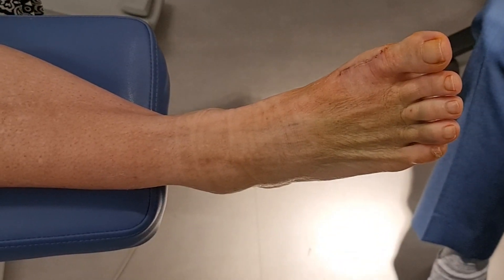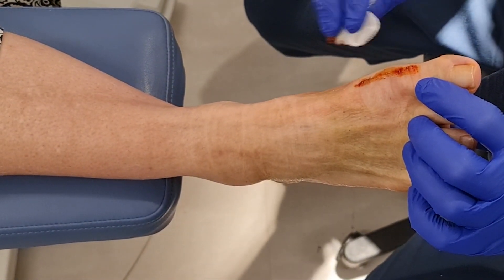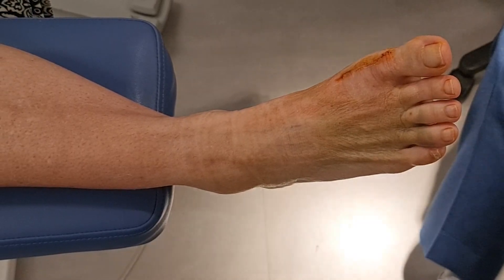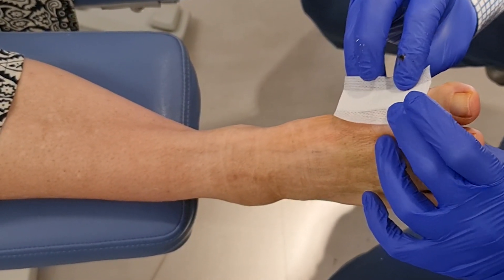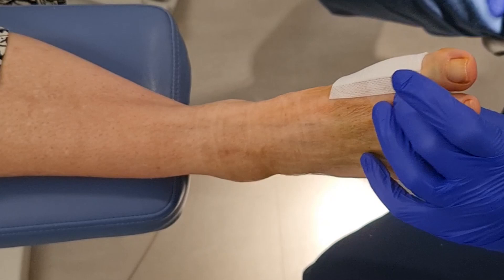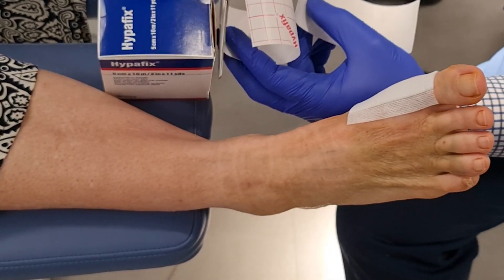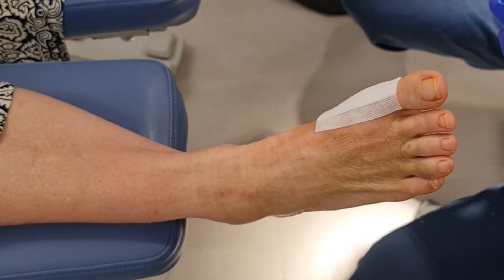Now let's go through that taping method. We're just going to apply a little bit of betadine along the incision line — you won't need to do this after today, because we cut the sutures. Those little tiny holes will be closed up in about 24 hours, and then you can get it wet. With the strapping, we're going to use Hyperfix — it's a hypoallergenic tape — and we're going to use two strips. I'll give you some so you don't have to go searching for it, but you can buy it from most pharmacies. If you can't find Hyperfix, there are equivalents.